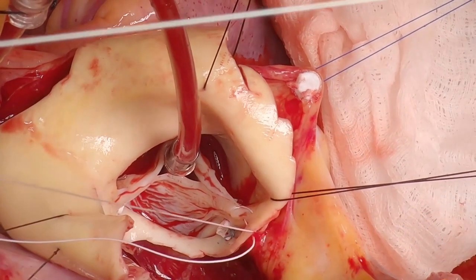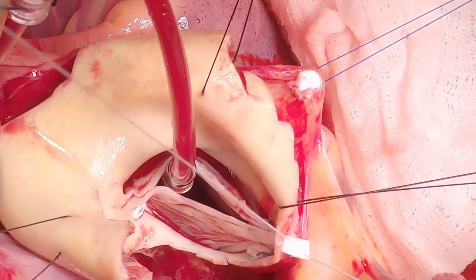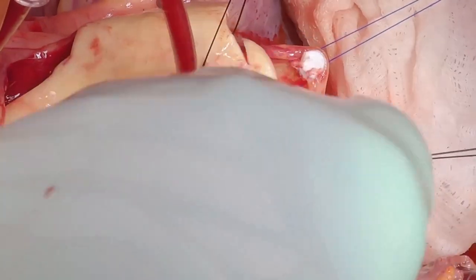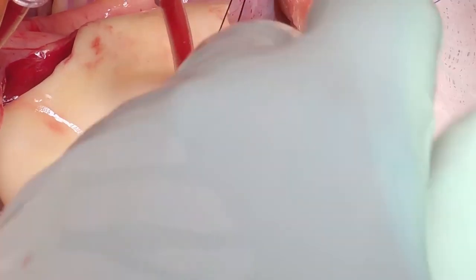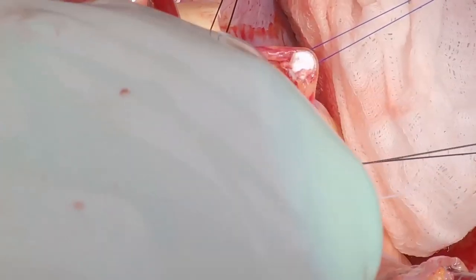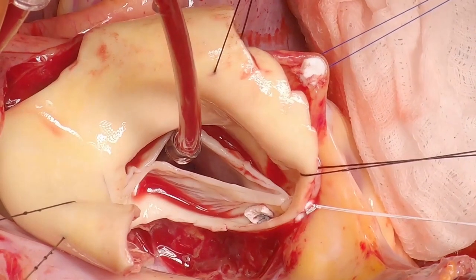I used to use Ethibond but stopped after one patient where the repair failed and the Ethibond had torn through the leaflet. After switching to Gore-Tex, that hasn't occurred — perhaps because there's a slight elasticity or it's less of a cutting suture. Because there's a lot of tension on the suture and a risk of unraveling, I put a clip on that knot so it won't unravel.